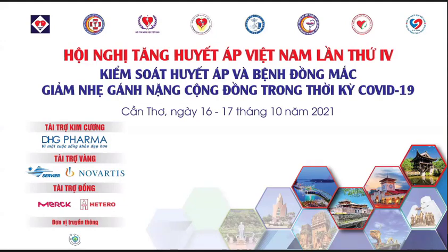Dear professors, after some time the patient's heart rate became too slow and blood pressure was not stable. The patient became very fatigued, and the monitor showed a slow heart rate compared with when the patient came to hospital, and we could see on the EKG the QRS was completely wider. The blood test showed troponin I and BNP very high. The arrhythmia became aggressive, so we thought a temporary pacemaker should be indicated to prevent the hemodynamics becoming more unstable and to keep the blood pressure.